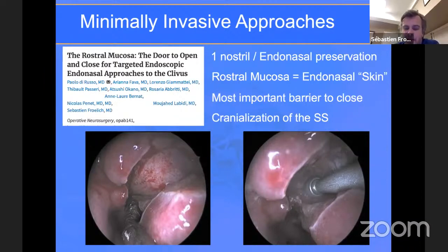We make an incision. We drill the rostrum of the sphenoid, which gives us a lot of space to work. We get into the sphenoid sinus. We remove the mucosa of the sphenoid sinus. We remove the tumor on the clivus, on the sella, cavernous sinus eventually. We use this working space given by the sphenoid sinus and the tumor, using angled instruments.